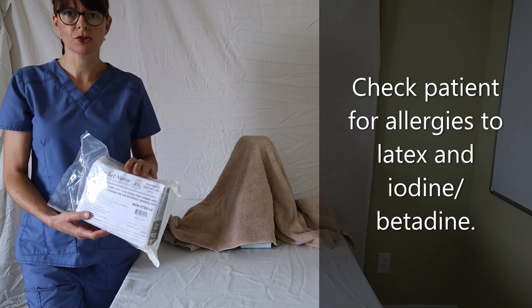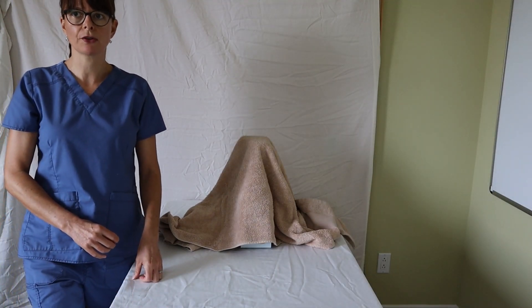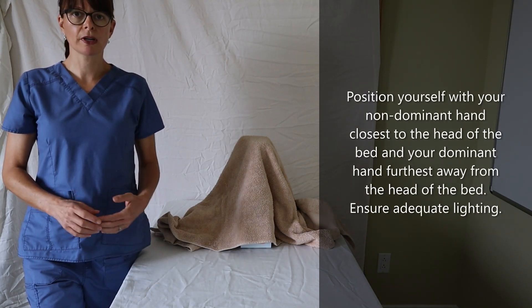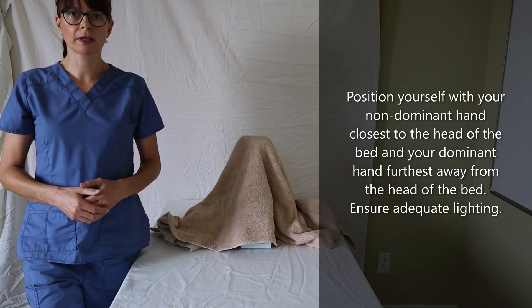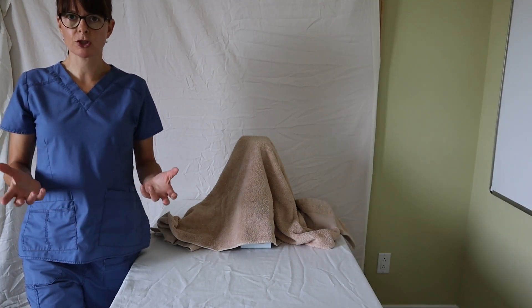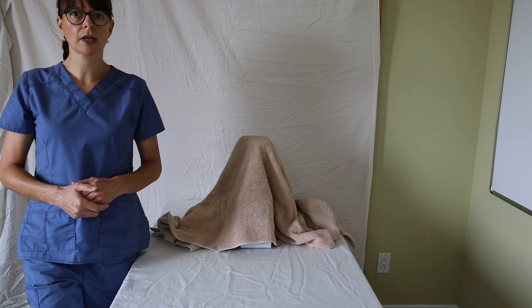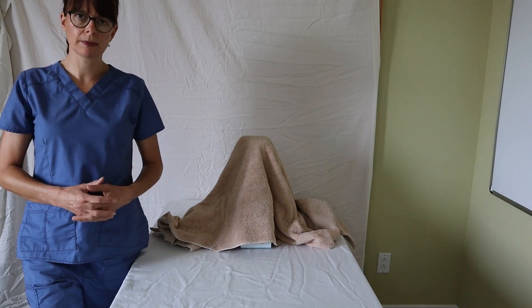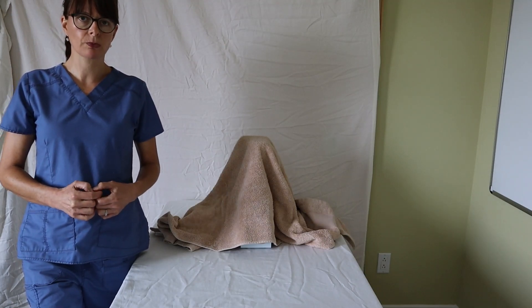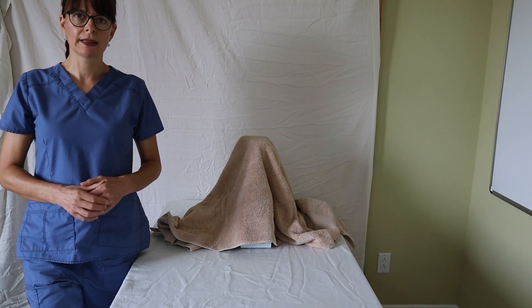We always want to prep the patient by providing peri care before we insert the catheter, and especially in female patients it helps if you inspect the peri area first and take a look at the anatomy, since it can be very different from patient to patient given their body habitus, maybe if they've had childbirth or any other anatomical differences. It also helps to have a little gooseneck lamp available so you can see the anatomy better. When you do peri care, it's a perfect time to familiarize yourself with the patient's specific anatomy and have all the equipment ready.